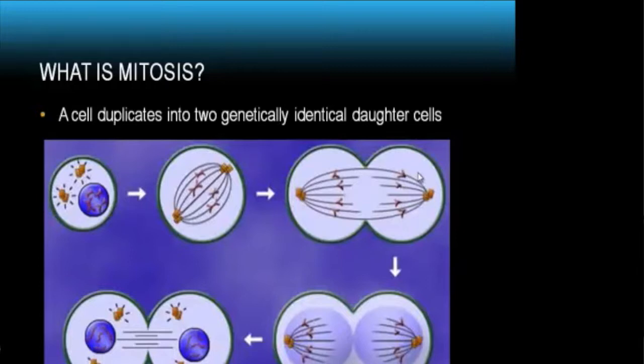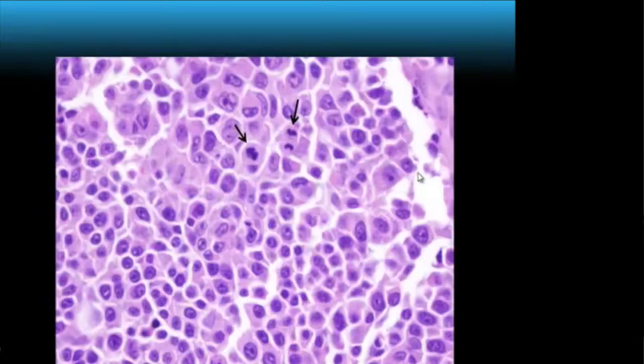And we actually can appreciate mitosis on the H&E slides. So I have an example of a high-grade neuroendocrine tumor here. In this high-power field, I cannot see, but you can see the arrow in the picture. This arrow points to mitotic figures. So one of the mitoses here is just starting to separate the 2 copies of chromosomes, and another one here is almost 2 cells formed. So that is mitosis. And like Ki-67, we always use mitosis to grade the tumor.